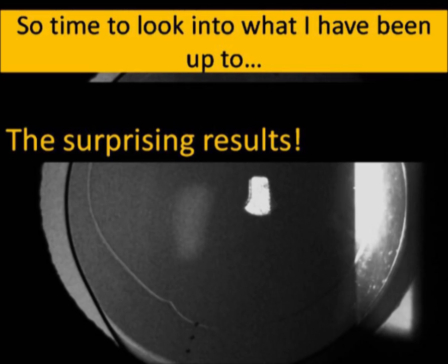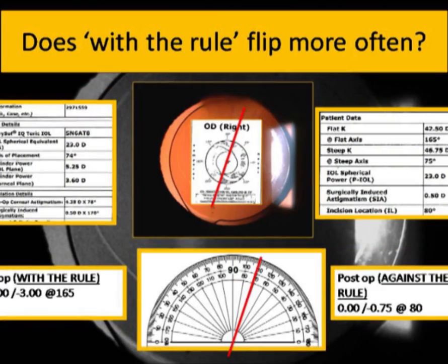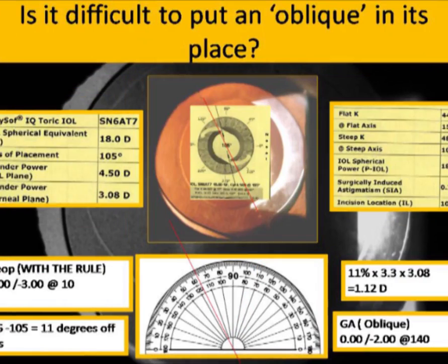The surprises were patients with residual astigmatism at final glass appointment with a flipped axis. Patients with perfectly placed intraocular lenses in the suggested axis with no misalignment had a flipped axis on their final glass appointment. Preoperative refractive error of with the rule astigmatism became against the rule astigmatism in the final glass prescriptions.